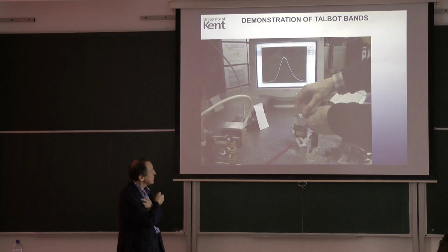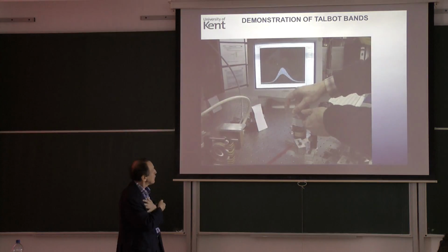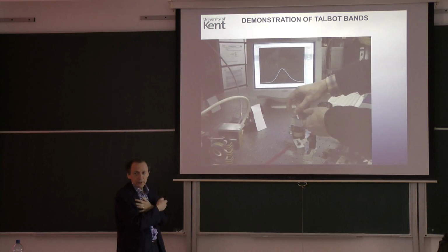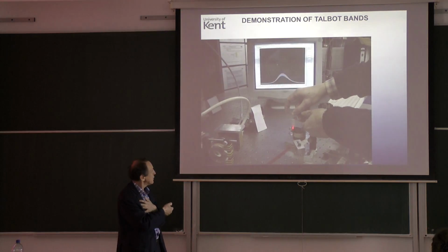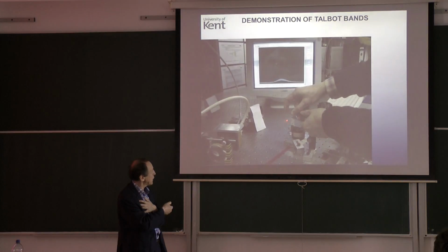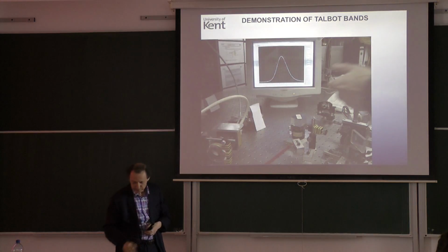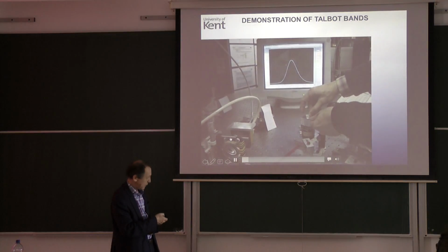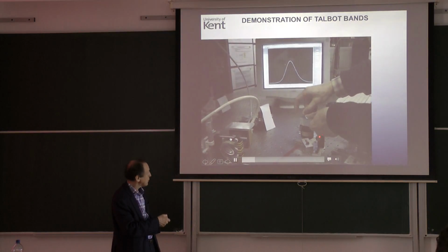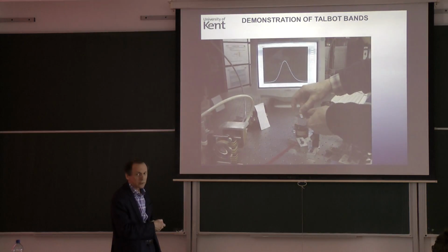So anytime the edge intersects the beam, I should obtain that modulation. However, I don't obtain it all the time. So look here. It happens, but it doesn't happen when I intersect this with the beam. Watch that again. So you see, I went through and there was no modulation. There is modulation only when I intersect this one.